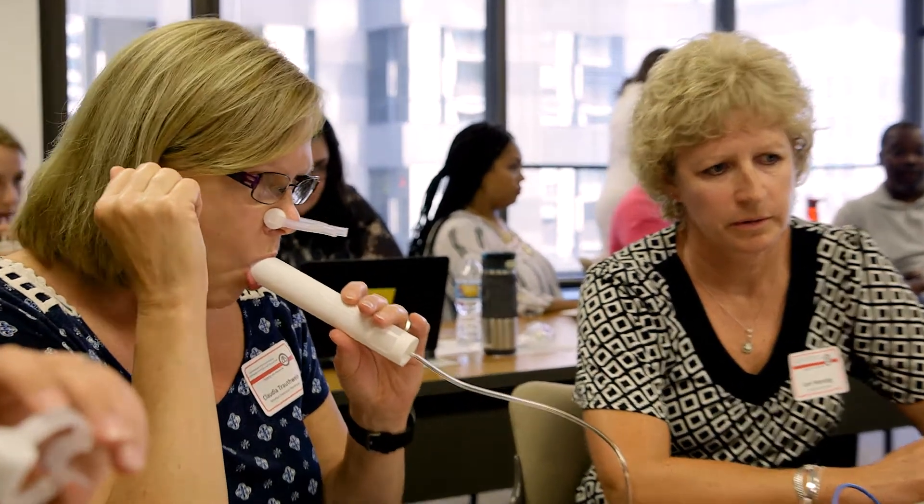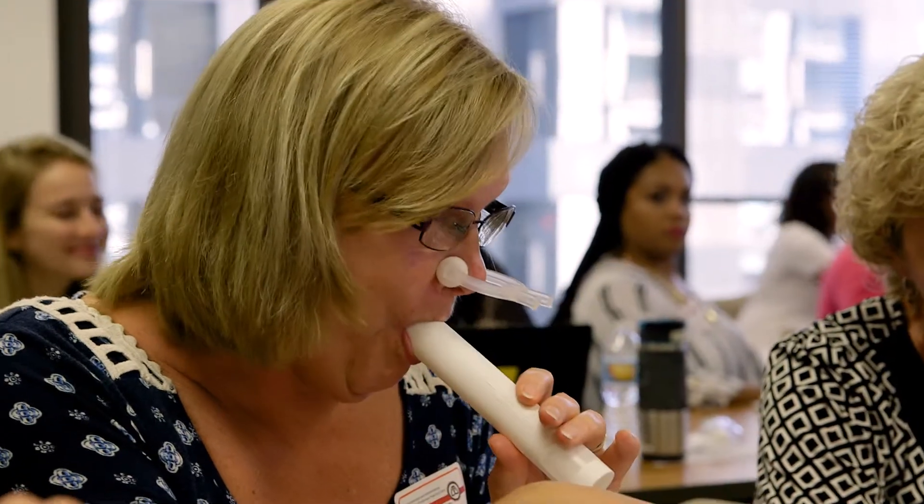The patient starts with breathing normally. Then they will be instructed to take their deepest breath. They blow as hard as they can and need to continue blowing until they don't have any air left — keep going, keep going, keep going.